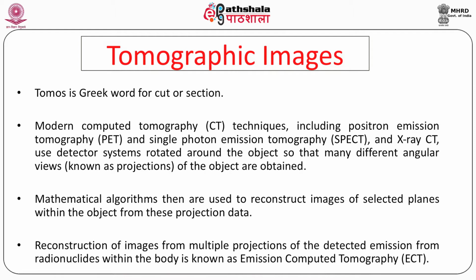What does it mean? It requires a mathematical algorithm. It is not a simple task when you are going to rotate the camera all around it and capture the image, when you are doing the acquisition of the images. Finally, you have to process those images. When you are processing the images, you require some kind of algorithms. Mathematical computations, some techniques are required, some formulas have to be written, some programs have to be written, and really that only makes reconstruction techniques and gives the images in a 3D mode.